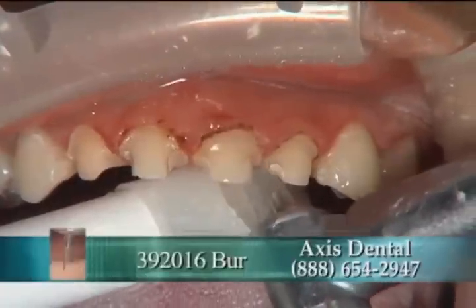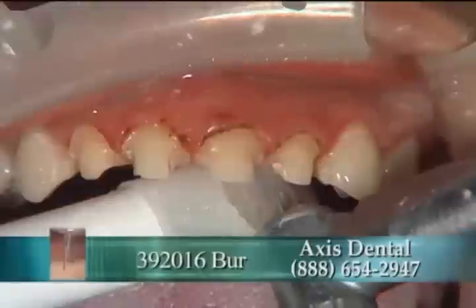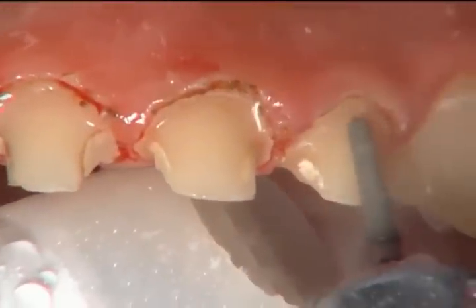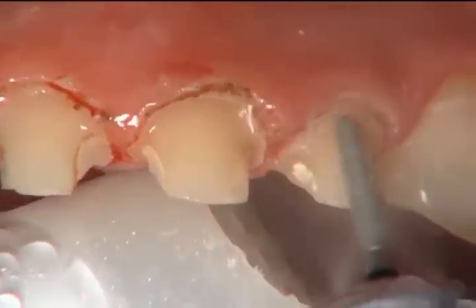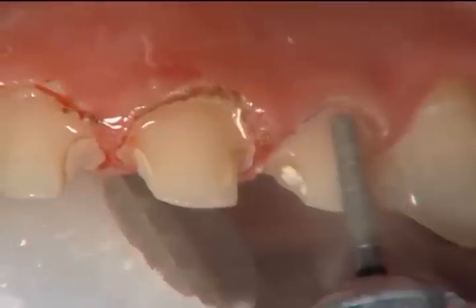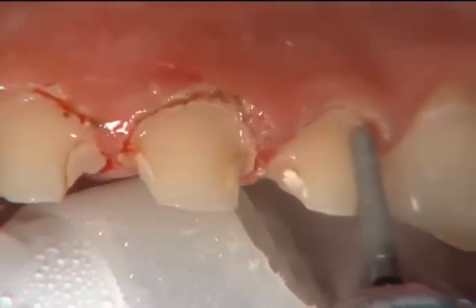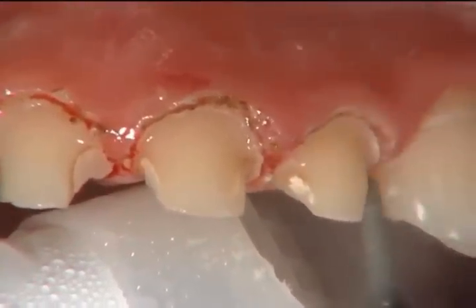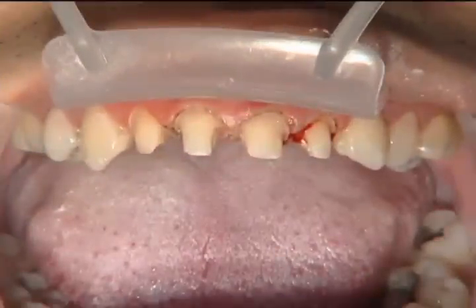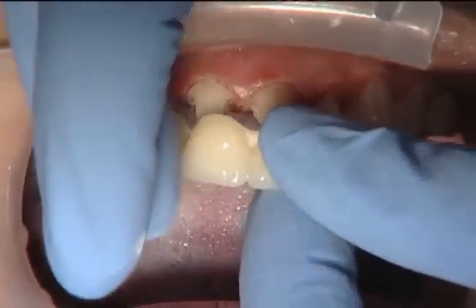Here I'm using a little mosquito burr to create a little more separation between the teeth — I love this little mosquito burr. We're also using our chamfer burr to create a deep chamfer or shallow shoulder on the facial of that lateral incisor. Because I touched the tissue, we have a little bleeding there, but that's not a big consequence since we're not going to impress today.